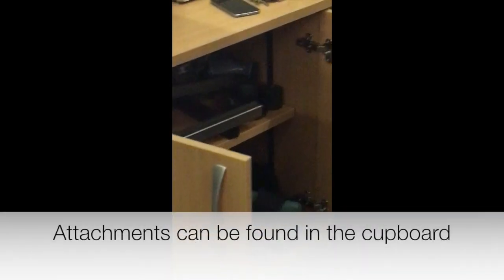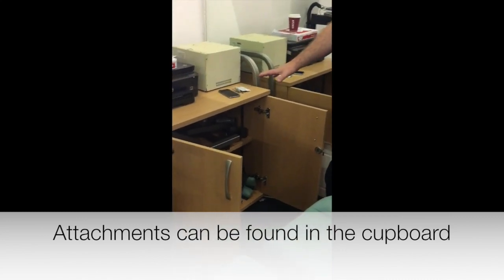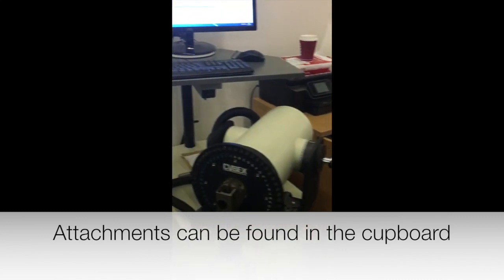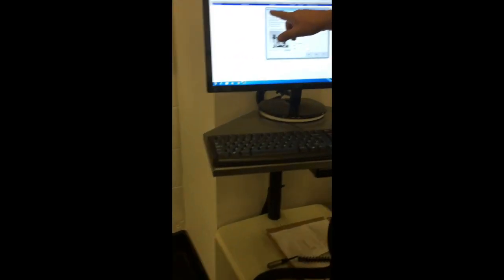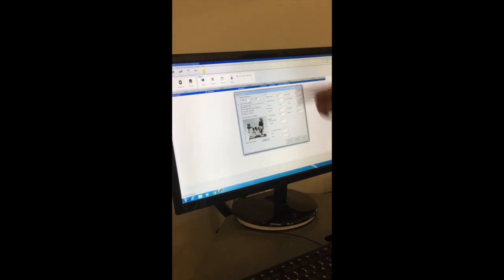Ta-da. There they are. In there, you'll find all the attachments. Everything, when you're finished, goes back in there, neatly. But what you'll find on this patient setup screen that pops up is you've got, again, a stepwise 1, 2, 3, and then what to do.